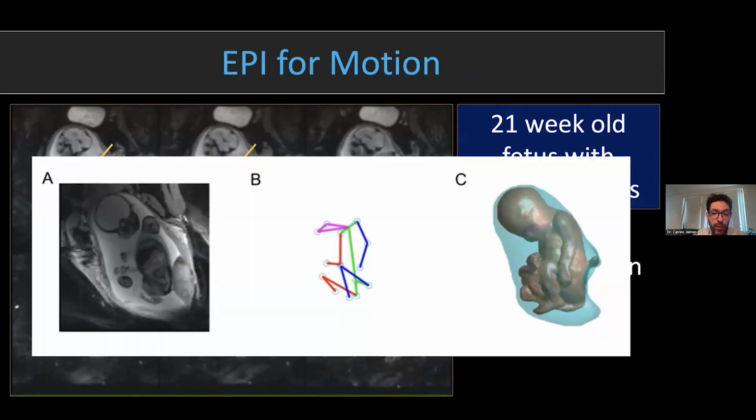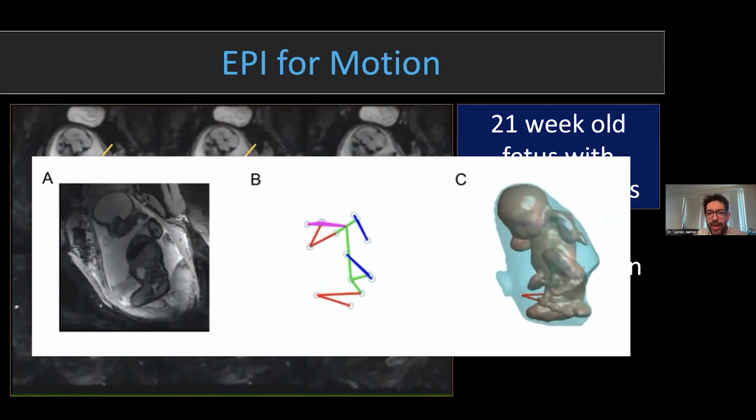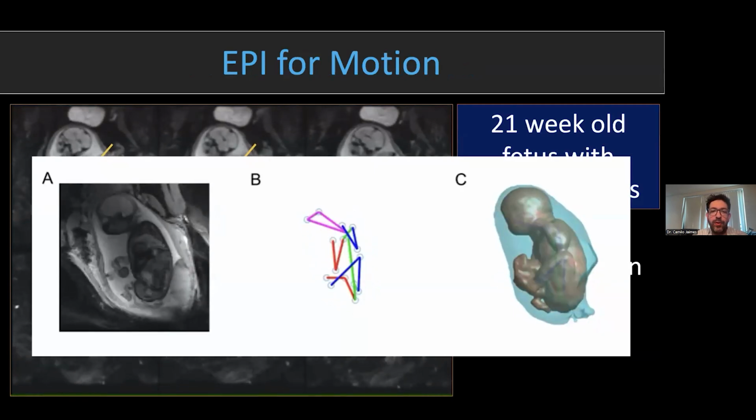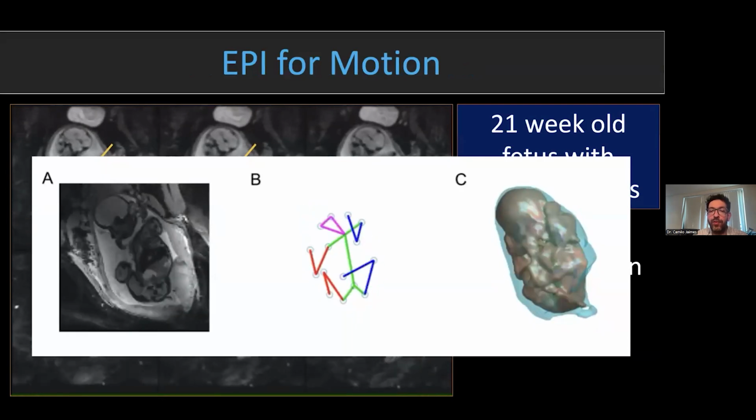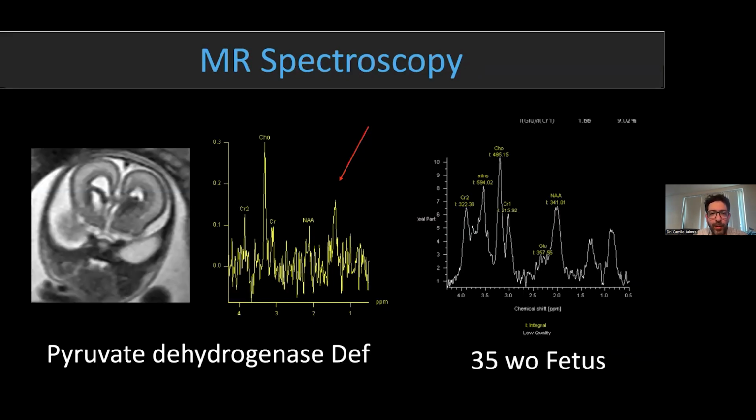There is really nice work that's been done here in Boston to put a quantitative touch on top of it and analyze the whole fetal body motion, as well as the motion of the extremities, which is modular. The last thing I wanted to show you, and as I was saying, I don't think I've ever directly cracked a nut with fetal spectroscopy, but it can be done.